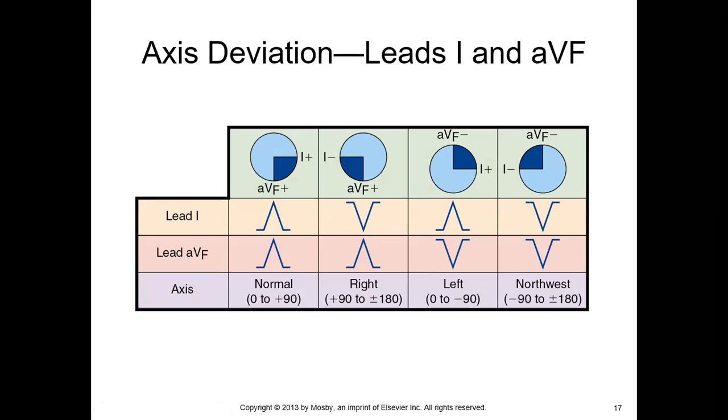All right. So now we're looking at leads 1 and aVF. See lead 1, aVF. They're telling you if it's positive, negative, right? They're telling you all of that. And let's take a look at what we have going right now.